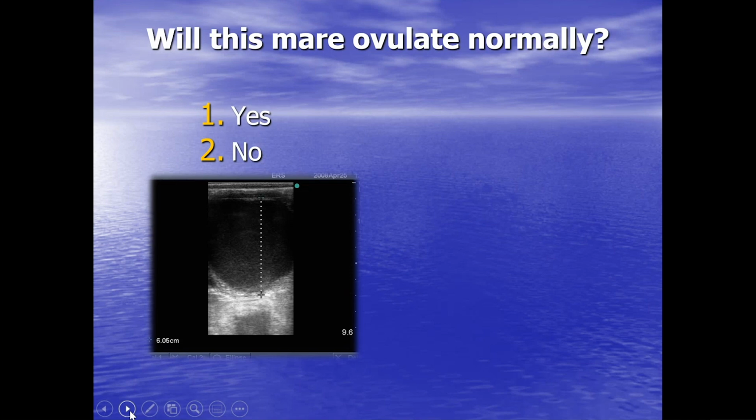It's big. There's no doubt that's large. Is it abnormally large? Difficult to tell. It's unusually large. And it still is a pretty spherical shape to me, that follicle. So when you've got a 6 centimeter follicle, we're not palpating it, so I can't give you the palpation information, but the ultrasound impression is not particularly a flattening and is retaining a spherical shape.